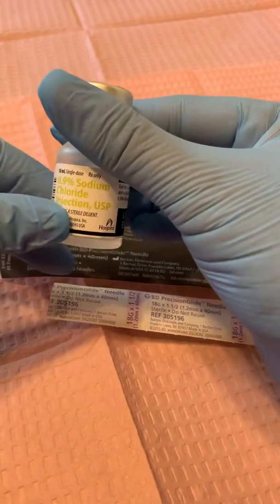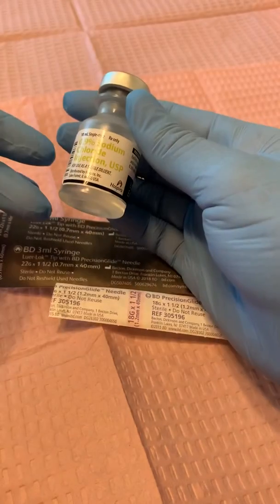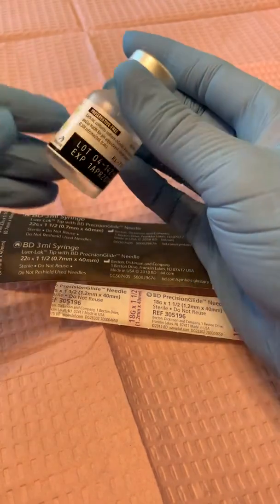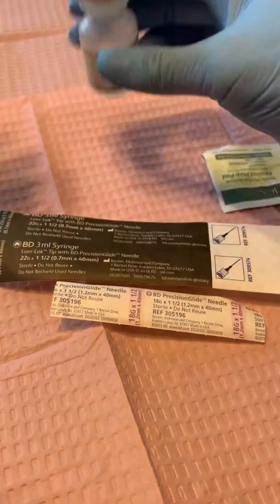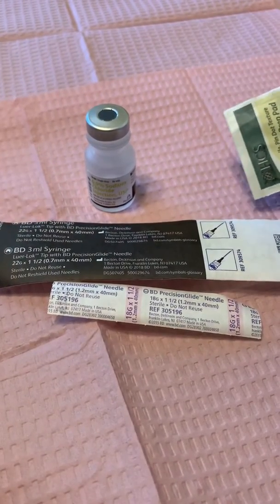Here we have our 0.9 sodium chloride — that's used as a demonstration medication, diluent, or mixing agent. In our case it's for demo. I have checked the expiration date, although we're not going to be injecting this into anybody today. I also have my alcohol wipe — you can also use an alcohol pump.